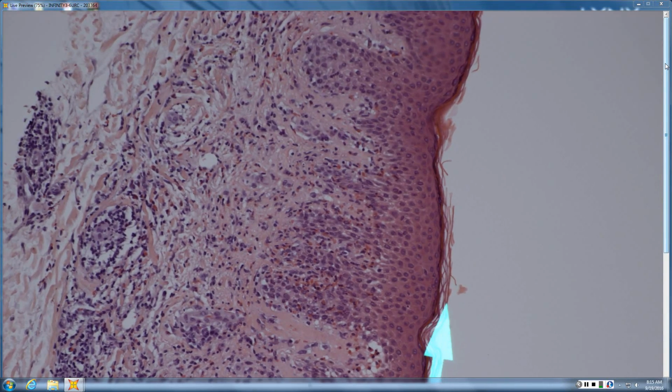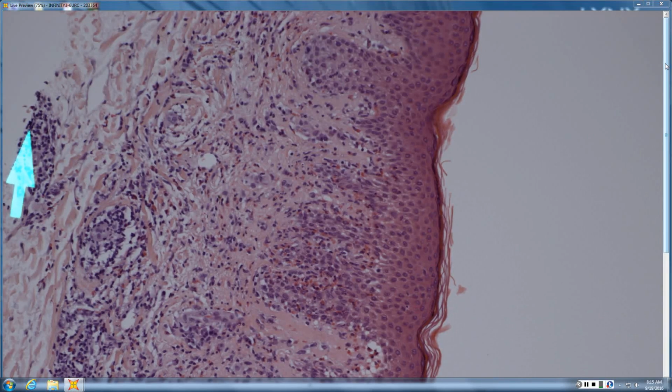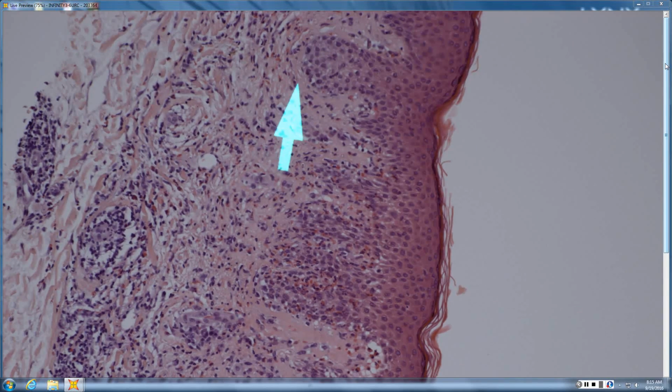Tell me about your corneum. Pretty basket weavy. And why do I see some pigment all the way down there? And why is there pointing, papillodermal fibrosis up here? In that case, I'd go with fixed drug. Go with fixed drug. Very good.